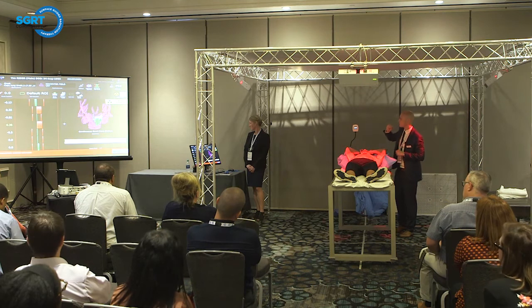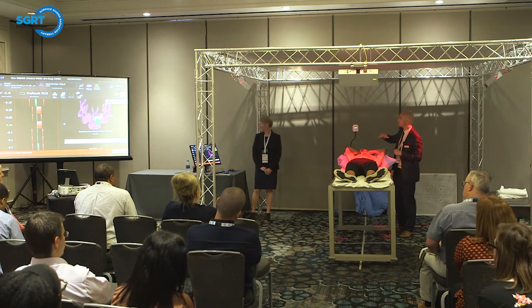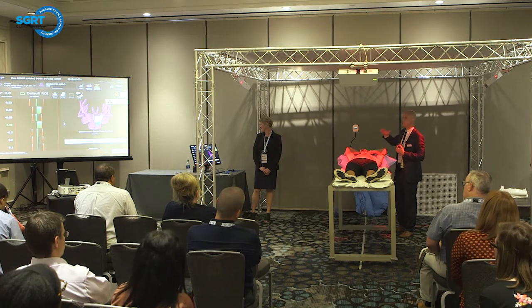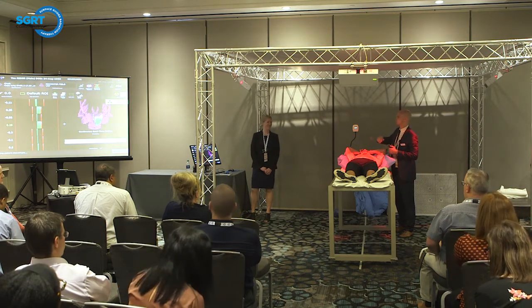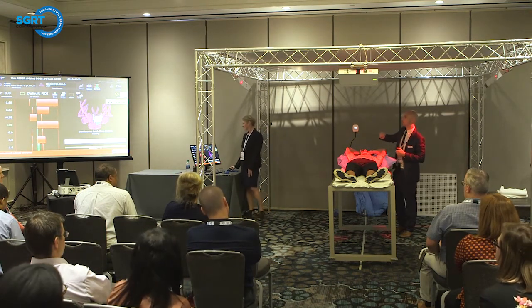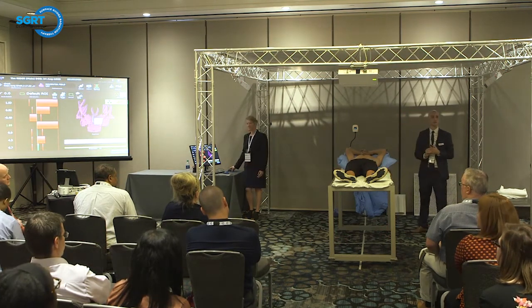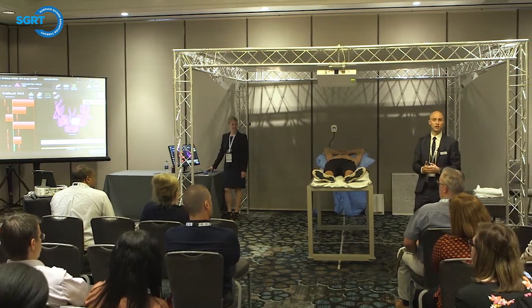Okay? And he's actually doing a pretty good job without even looking at it. So from here, if I needed to coach him, I could say let a little bit out, or take some more breath in. Whatever I needed to do, if he needed some additional help, I could coach him over the intercom. Okay, go ahead and breathe. Okay. Once we pause monitoring, this 2D plotter is no longer displayed. It goes back to our Bluetooth and flashing play symbol waiting for us to go. So the patient won't continue to breathe once you pause monitoring.